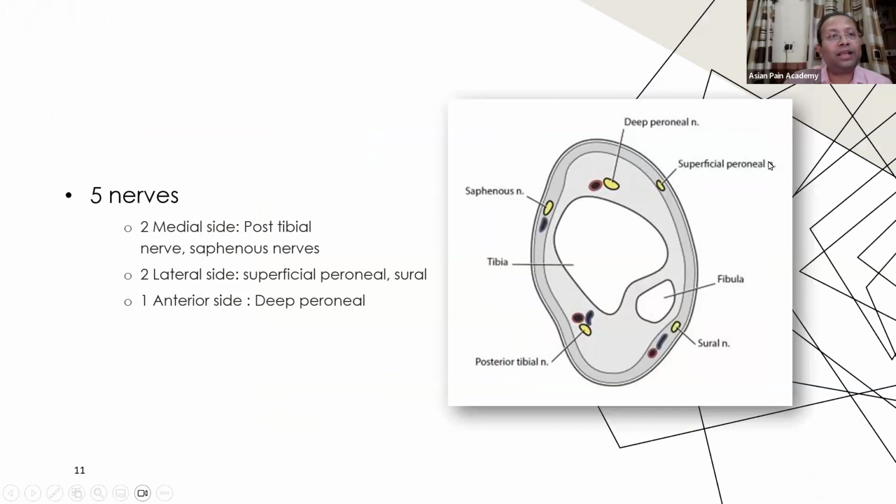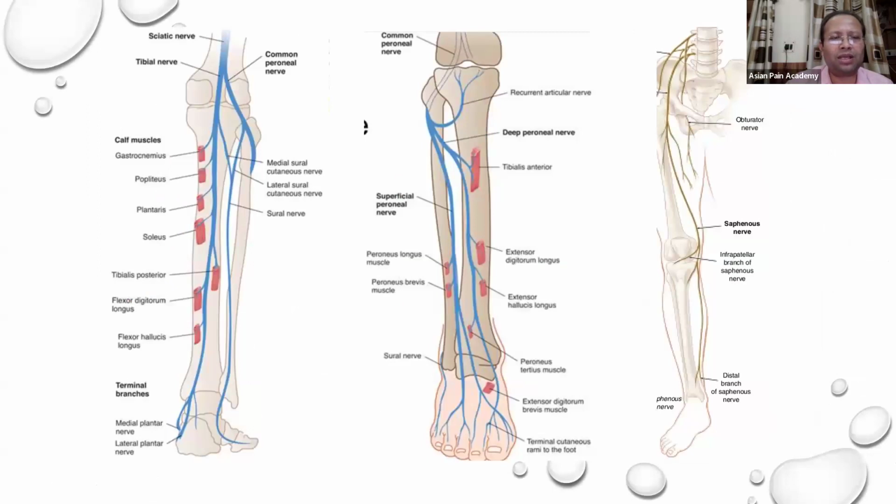And remember, these nerves are notorious for causing neuropathies. Which neuropathies? Post-procedural neuropathy, scar tissue, and post-surgical neuropathies also. So this causes neuropathies. Then we can go for hydrodissection. Sural nerve neuralgia, many times we get it because this nerve is used for biopsy purposes, for vasculitis and autoimmune diseases. After doing the biopsy, the patient sometimes gets neuropathy. Then you can go for sural nerve hydrodissection.